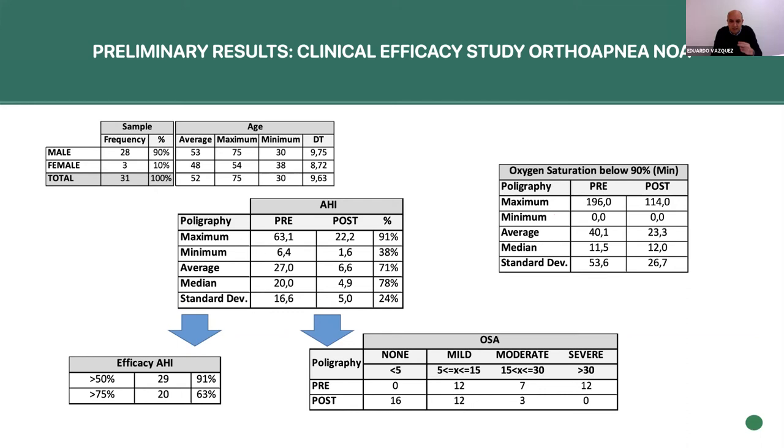In my modest opinion, I don't think that this is something that can be good for the temporomandibular joint. I think it's more reasonable, especially if the patient, for example, bruxes, that there is good mandibular stability. And I think that for the temporomandibular joint, it's better that there is posterior support. So no, we haven't thought of that particular design for the NOA.